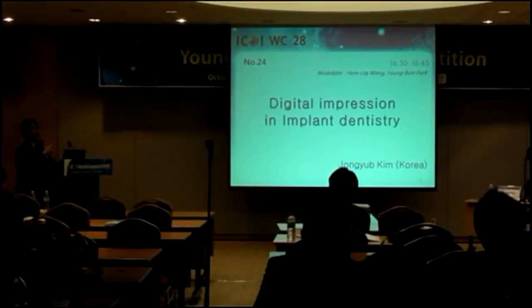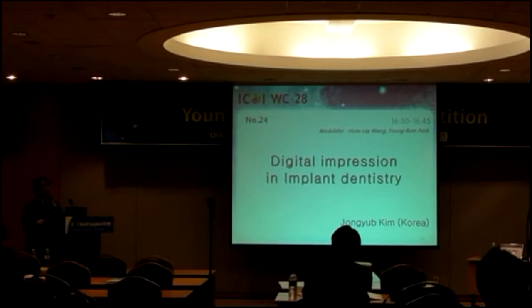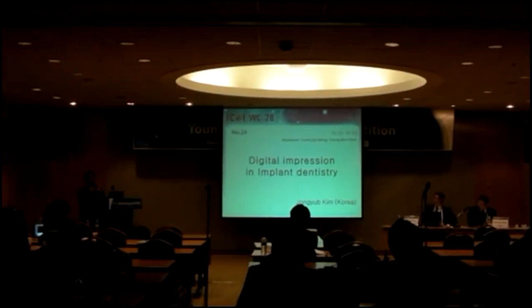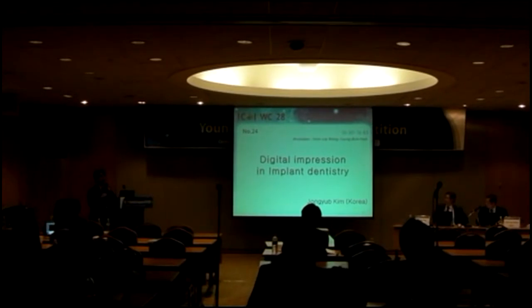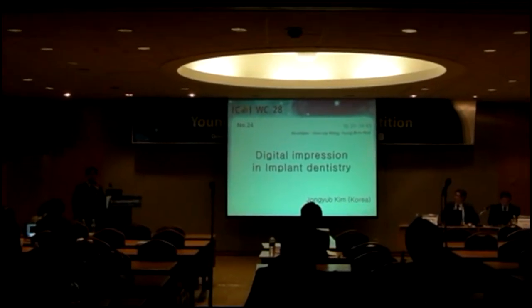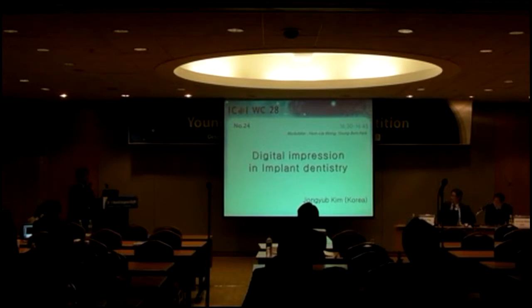But I had to use the external connection implant, because the 2.7 millimeter external hex is comparable to other companies. That's why I placed the external. A Korean domestic company called Dio has this system. If you place the implant with an internal connection, you can still make the digital impression.